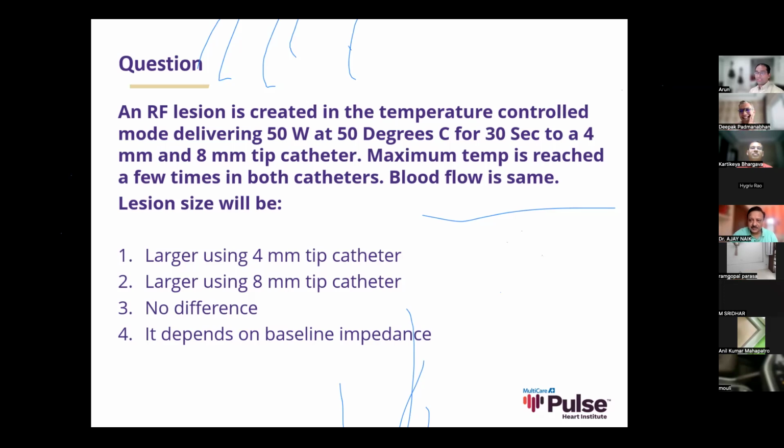Wow, I did not know that. I've not seen that. I would imagine it was for contact, Dr. Ajay, and correct me. More for the contact, you're at the ridges in the isthmus area, so you're trying to get to the anterior aspect of the ridge while dragging it back, and you could get into the dips a little better.